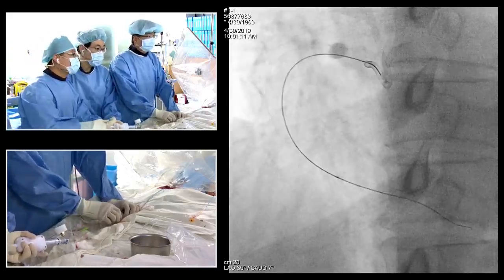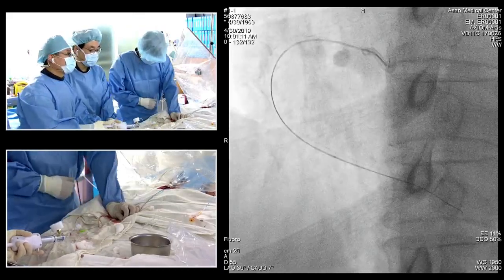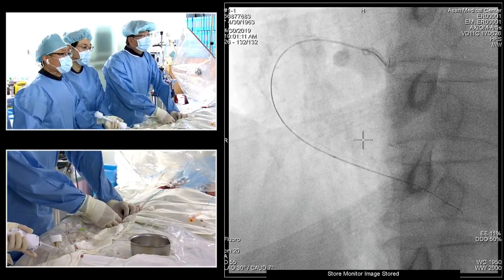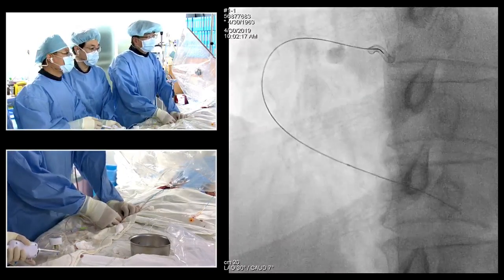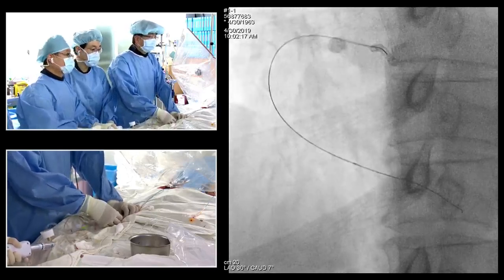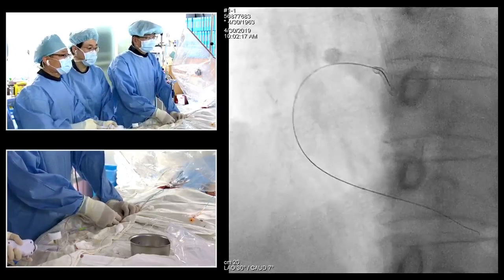10. 12. Once finished with the smallest balloon, the tissue friction will be decreased, and during your balloon inflation proximally, there's a higher chance of wire shaking and chance of injury to the distal. So you should be very careful. 10, 14. Okay, the balloon. Be careful of the location of the distal tip of the wire. Okay, 10, 12, 14.